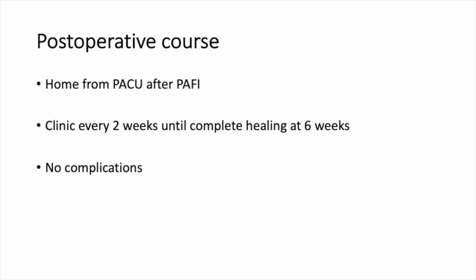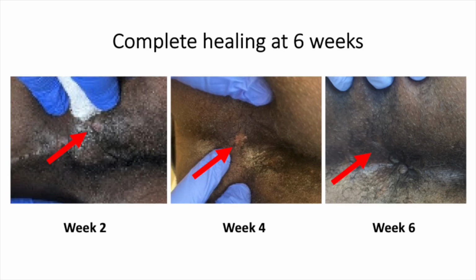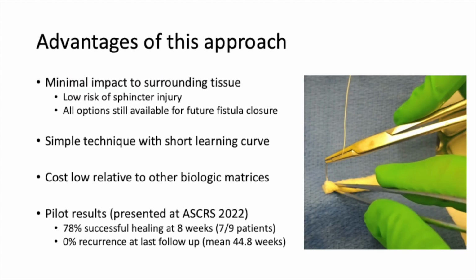This is an outpatient procedure, and following surgery the patient was discharged home. He was seen for close follow-up every 2 weeks until complete healing at 6 weeks postoperatively. These images show the progression of healing as the implant transitions into a granulating wound and ultimately into a fully epithelialized closed scar. This technique has several advantages.